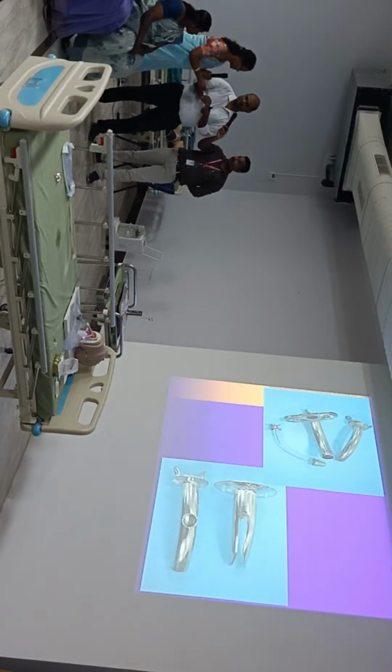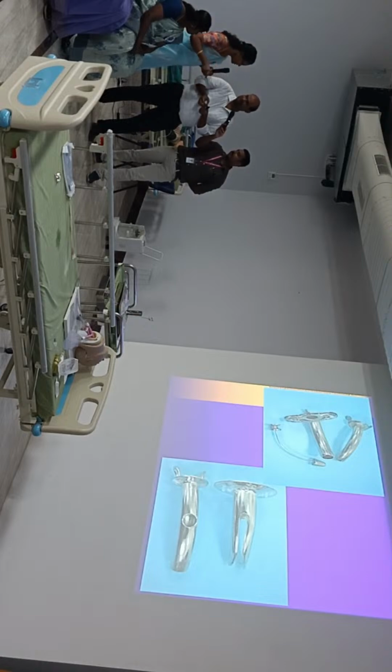I like your plan. Yes, the inner cannula is a little bit lengthier than the outer cannula. So what may happen here, or what is the advantage of this tube over that tube?